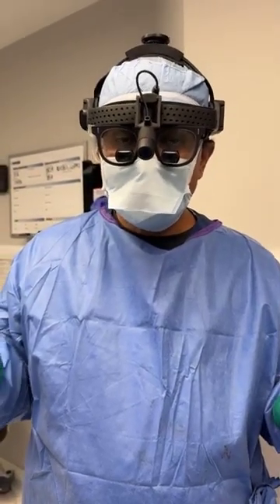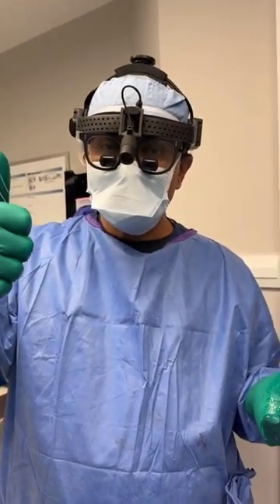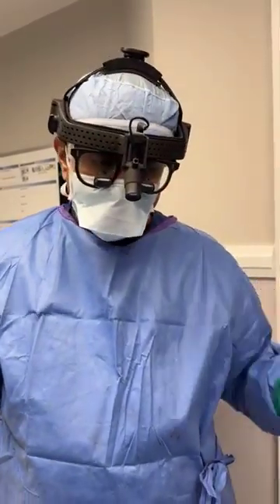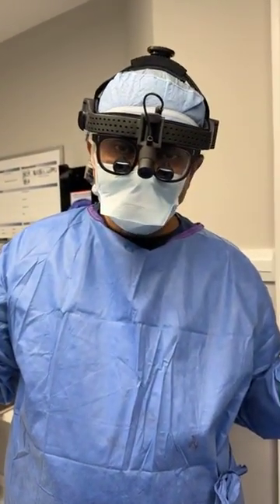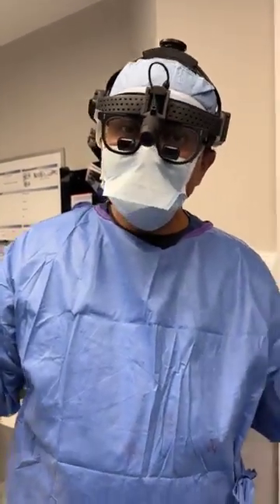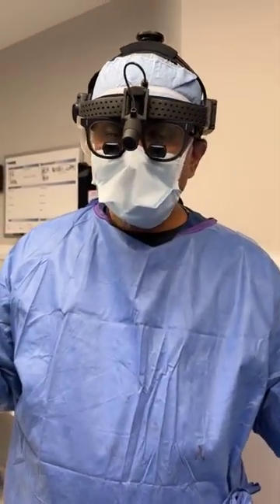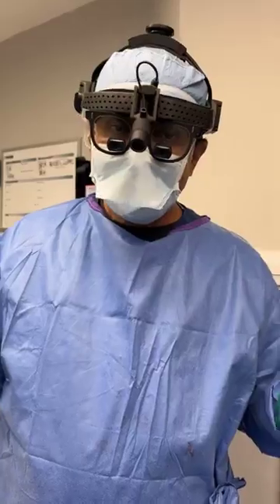A patient will have the peace of mind that, number one, all of the implant capsule and inflamed tissue is removed in en bloc fashion, and number two, all of it is going to be tested. The implants will be returned to the patient. Capsules will be sent to pathology to rule out BIA-ALCL, CD30 analysis, that very rare cancer, amongst the other cancers, including breast cancer. The right and left mastectomy scars will be sent to pathology. Cultures are going to be done for aerobic, anaerobic, and fungal. And there you have it.